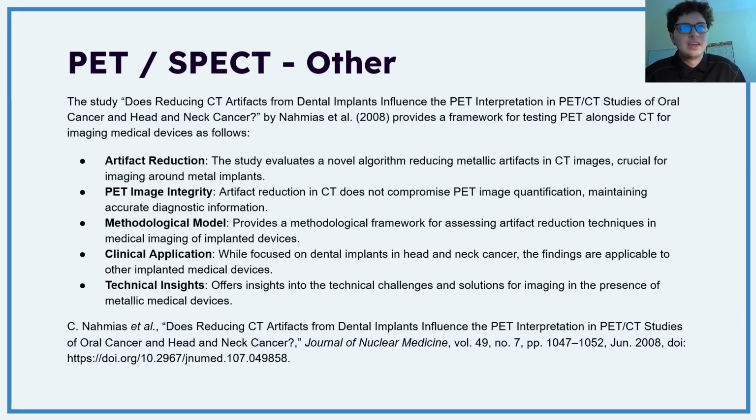So outside of the FDA, there's a little bit more. I found a really nice article overviewing the dental implants' influence on PET interpretation. A lot of the times with PET or SPECT, we're going to be using dual modal imaging techniques, usually combining it with CT, so you'll have some anatomical and functional data.